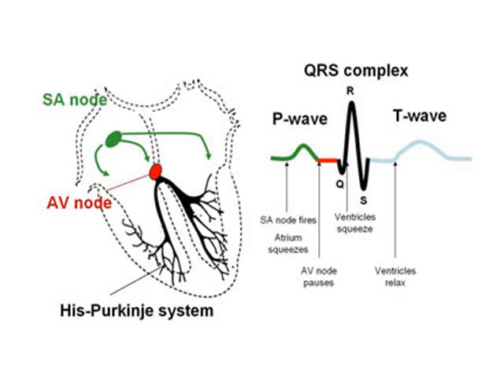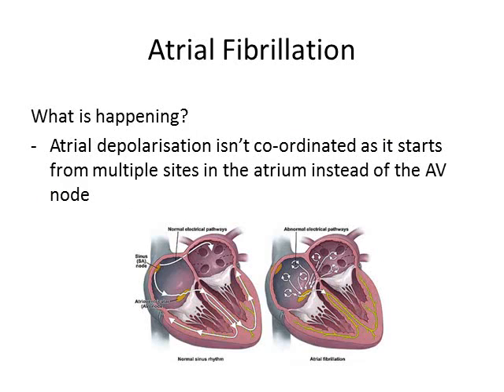So looking at what we're looking at now, atrial fibrillation, it's all this area here that's affected. It's the P wave. And on the trace, we'll be looking particularly at this part of the trace. So what causes it? Well, basically, you end up having small areas of the atria setting off impulses rather than one coordinated impulse going through the heart. So you end up having little specks, which are these little white things here, going off. And it's often described as being like a bag of worms, just moving like that.